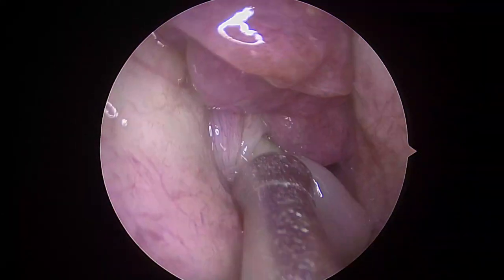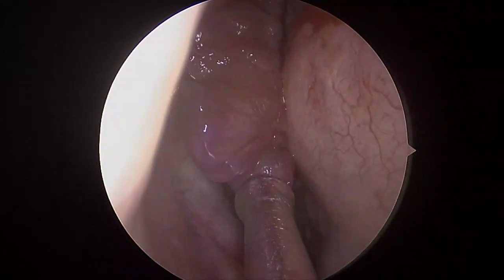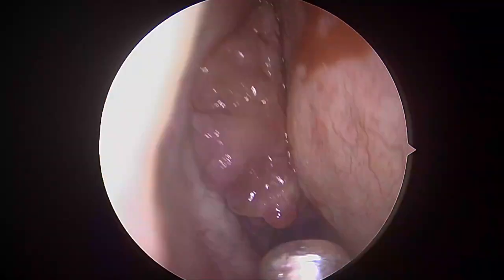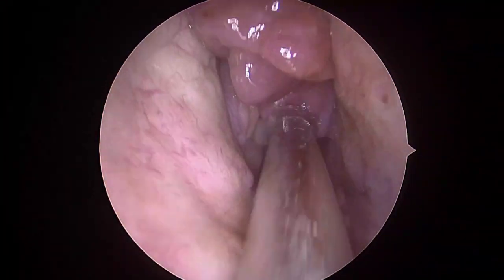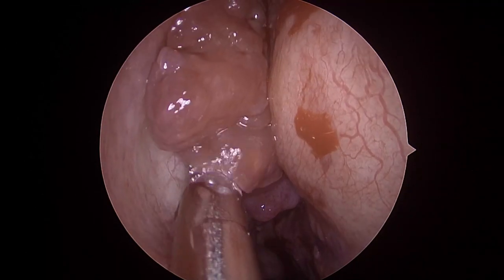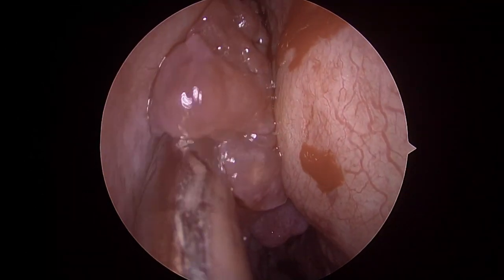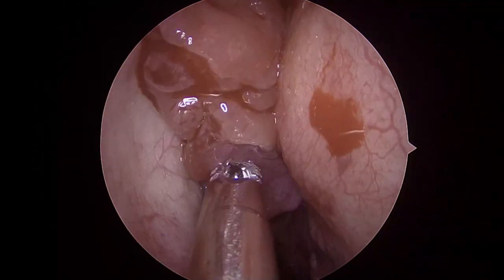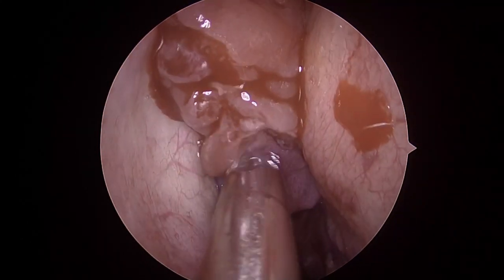So, as you can see, we have polyps in the middle meatus. I can't differentiate the middle turbinate here. So, we take a microdebrider or a shaver and start debriding the polyps.